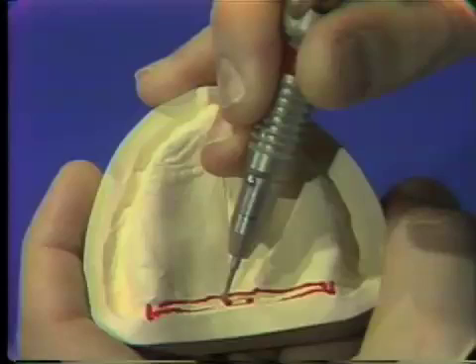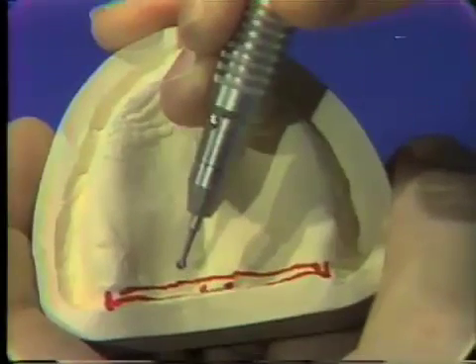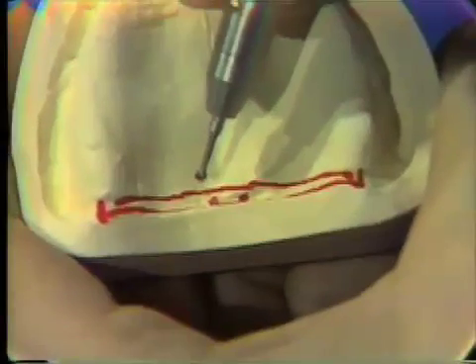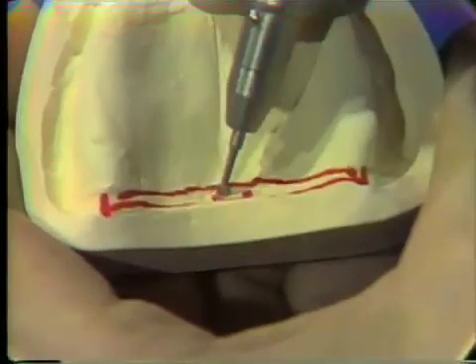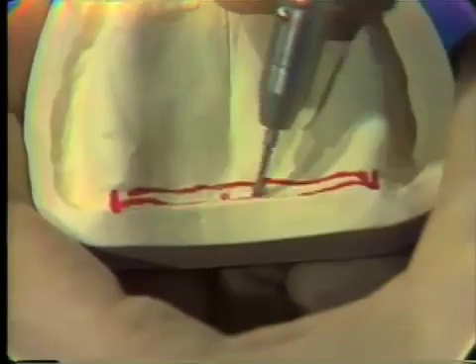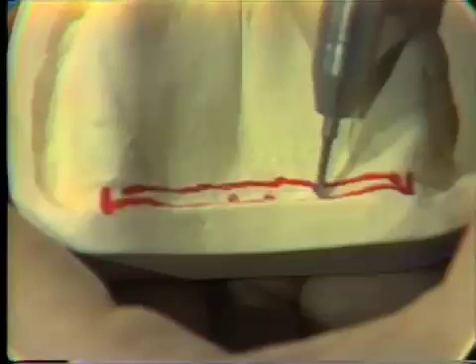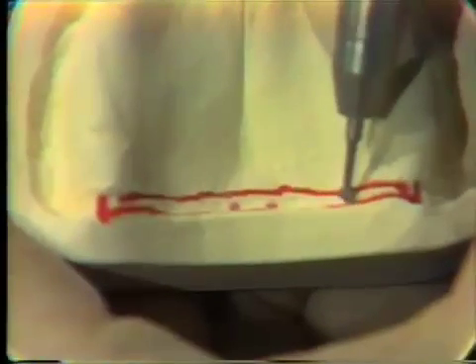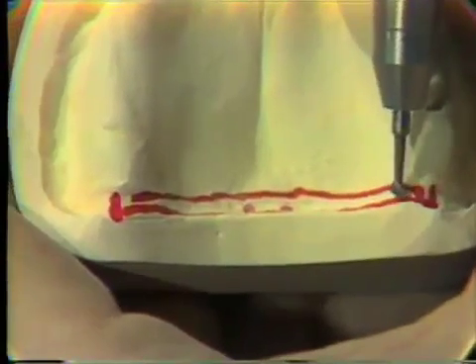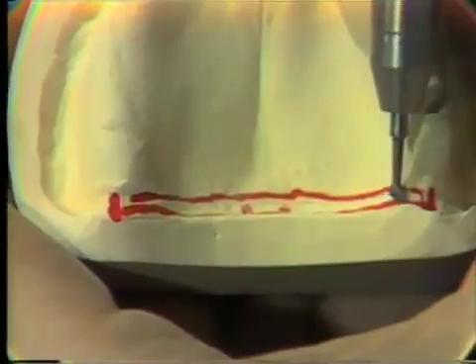The depth of the line will be approximately one half the depth of the number eight round burr. And we scribe this line from the midline to the hamular notch area.